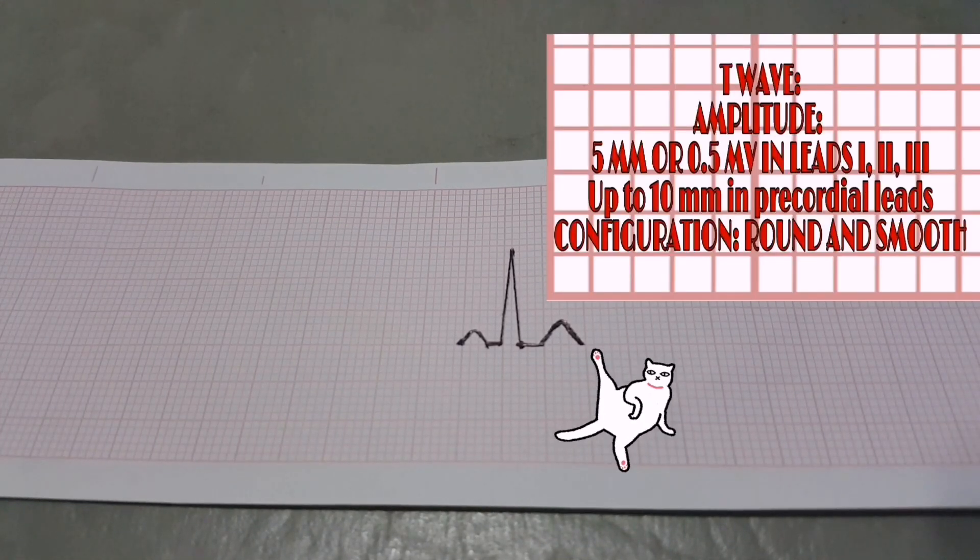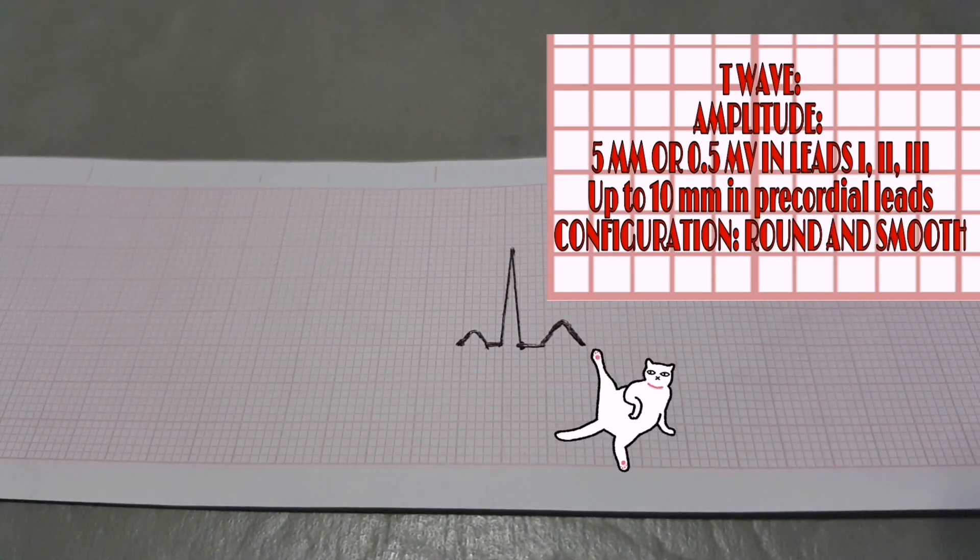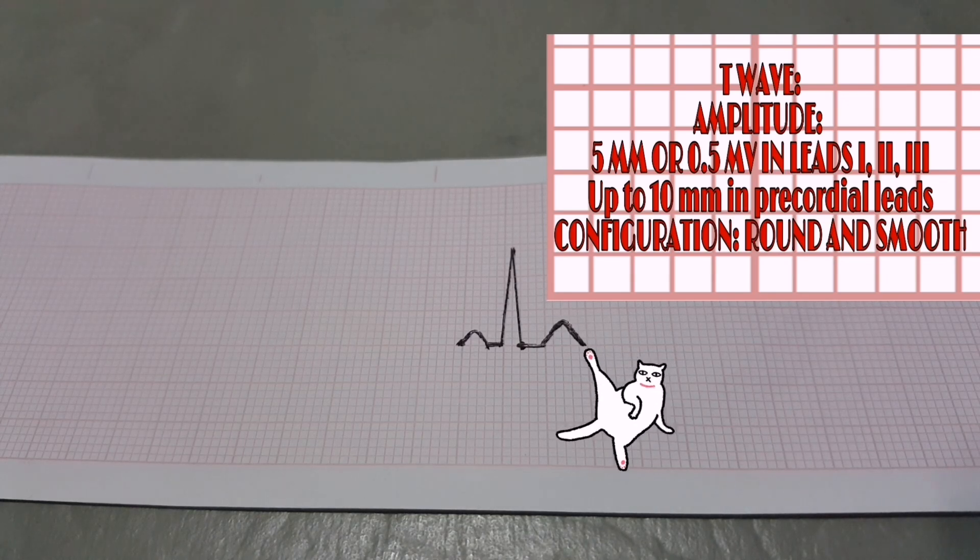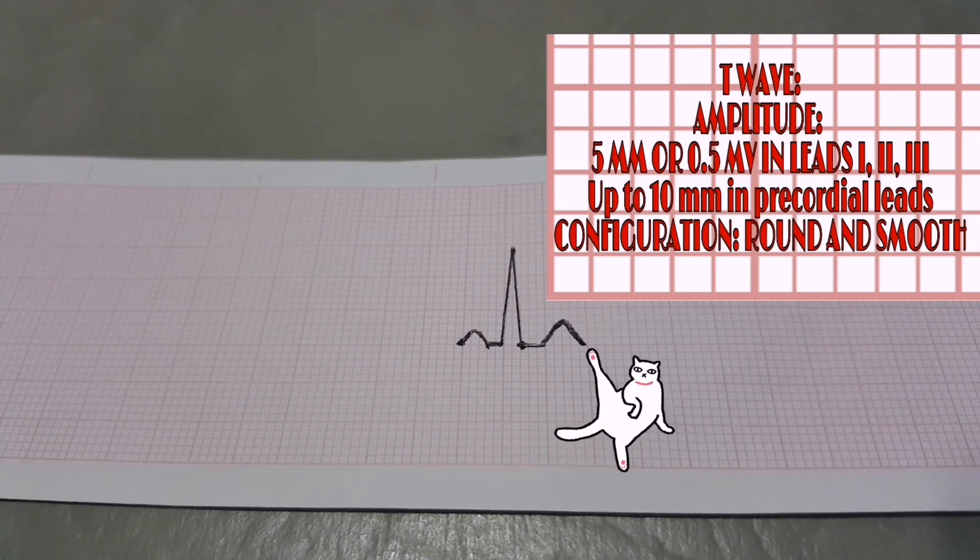The T-wave represents ventricular repolarization. It occurs after the S-wave. Amplitude, 5 millimeters or 0.5 millivolts in leads 1, 2, and 3, and up to 10 millimeters in precordial leads.